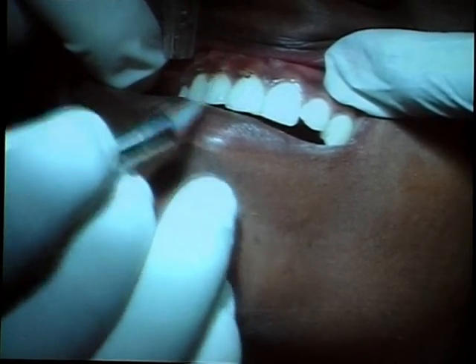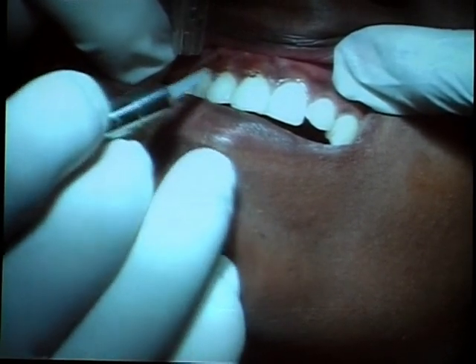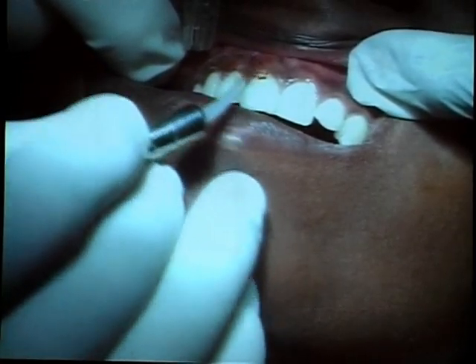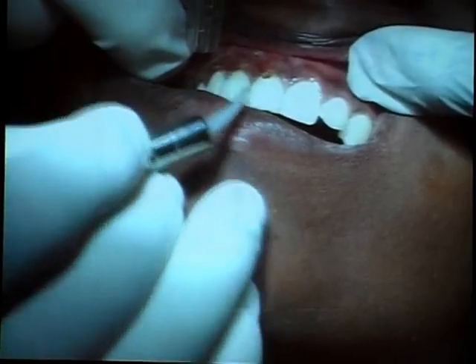Okay, as you can see, the areas were much smaller, but depigmented. So we're nearly ready on the right side.